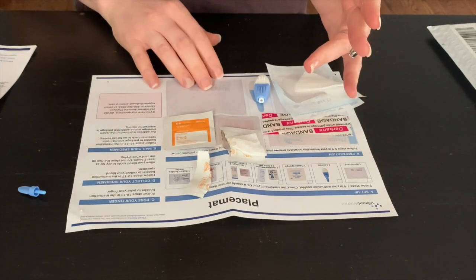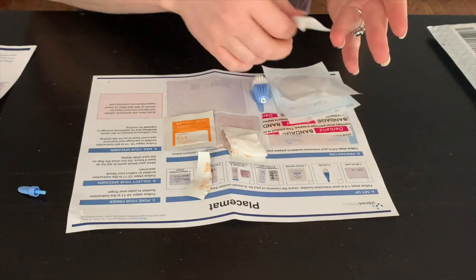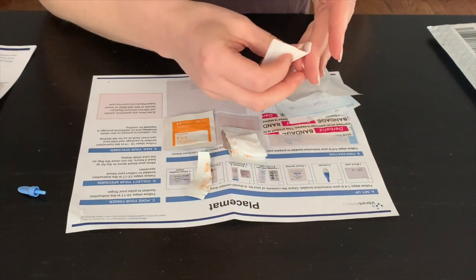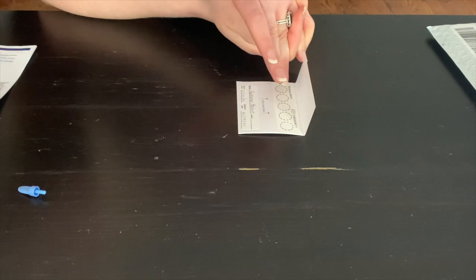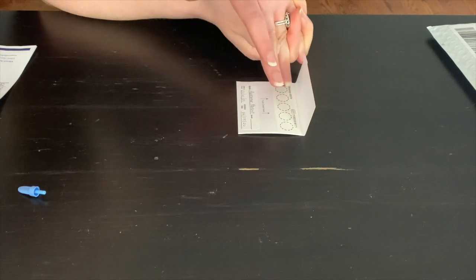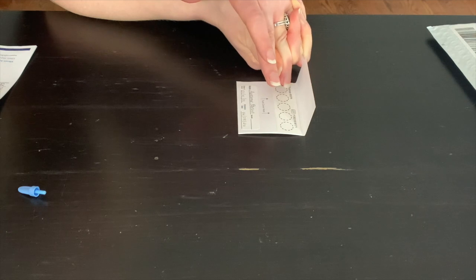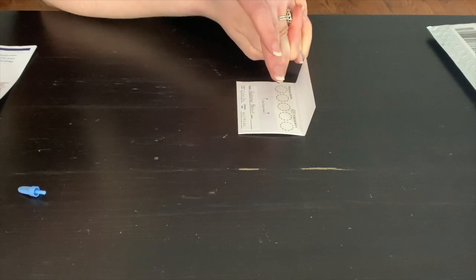Wipe the first drop of blood away with the gauze pad. Milk your finger from base to tip to produce more blood. Allow a drop of blood to form. Let the blood drop fall from your fingertip into the collection circle.